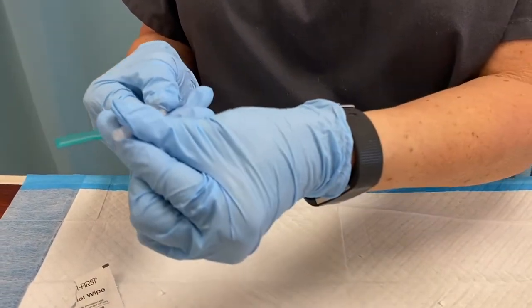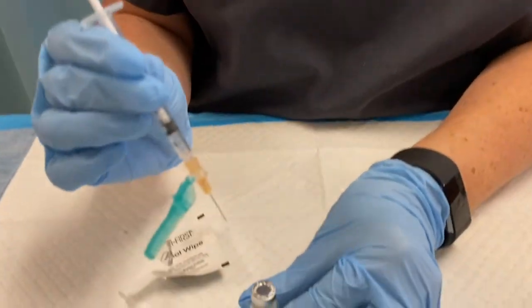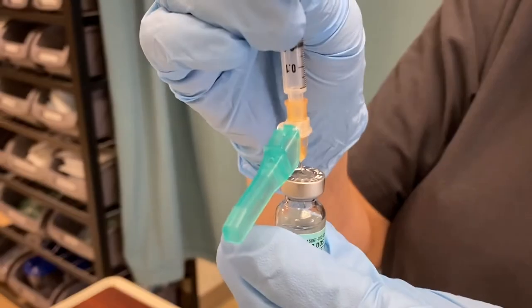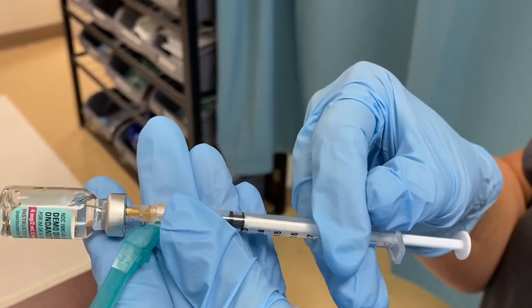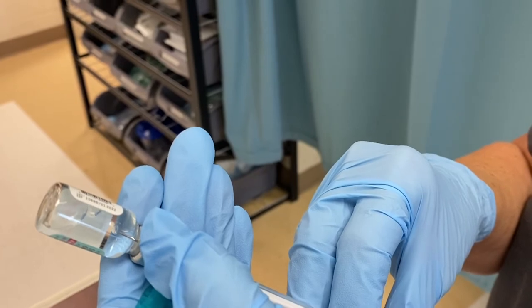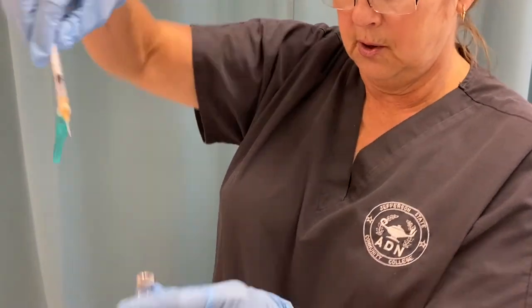With your tops, you pull straight out, straight off. You always want to inject air to air — I'll show you why in a minute. You put your needle down. Now, you always want to put air into air. If you don't insert the air and you go ahead and turn your vial, if you inject that air in you'll see all the bubbles — you're just adding air to that vial, which might make it harder down the road when I put air in and I may not be able to get the amount out I need. I'm going to show you the correct way.